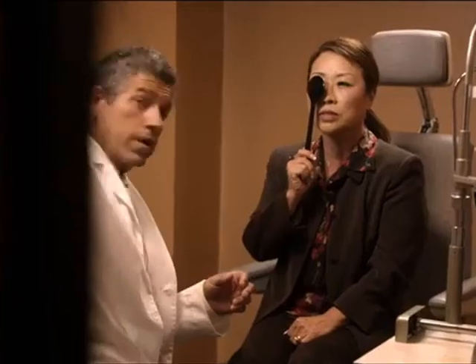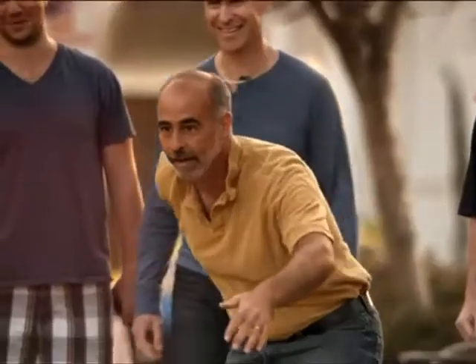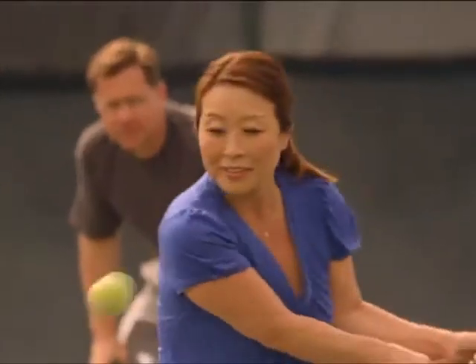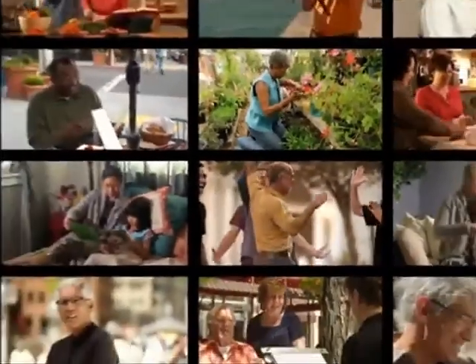Your doctor may choose to treat your astigmatism at the same time as your cataract surgery. If you have astigmatism, your doctor will talk to you about the different treatment options that are right for your eyes.